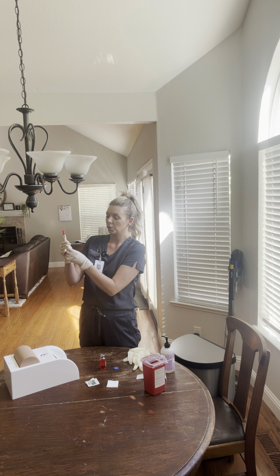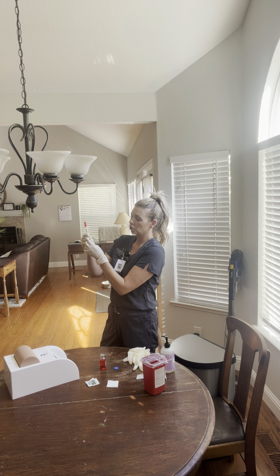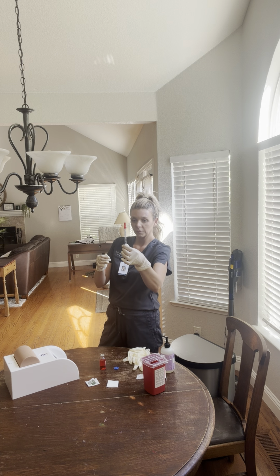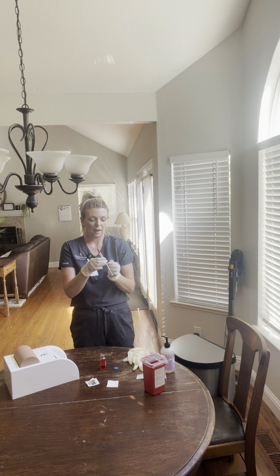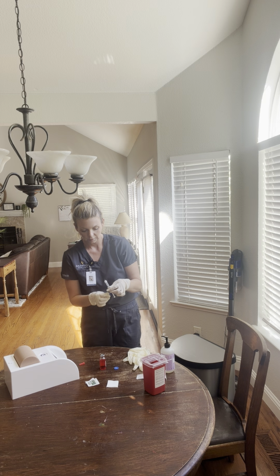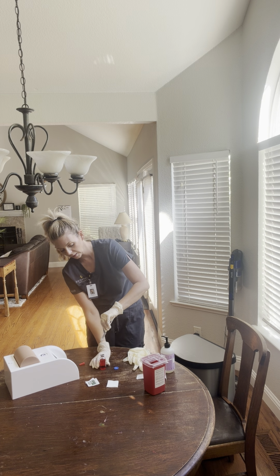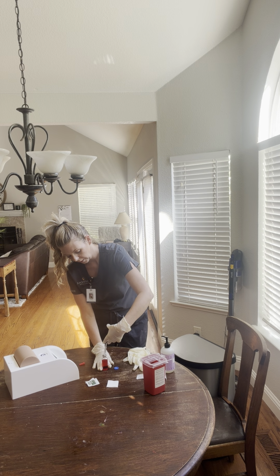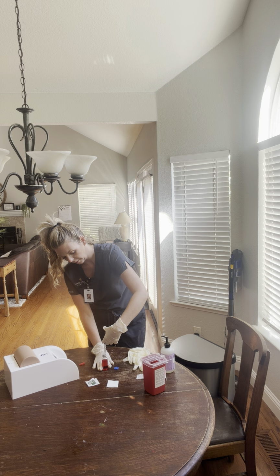I'm going to, without uncapping the needle, withdraw 1 milliliter of air. And I'm going to uncap my needle, and I'm going to inject this directly into my vial. I'm going to slowly inject the air into my vial.